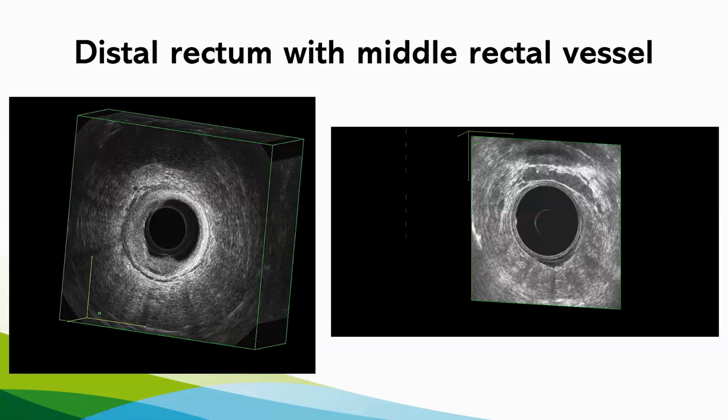Thank you, Dr. Nina, for this very interesting presentation. I wanted to glimpse an insight into the practice in Korea by asking what the Korean guideline for staging of rectal cancer says. Where do they have EUS in the guideline, or what specific role does it play in the guideline?